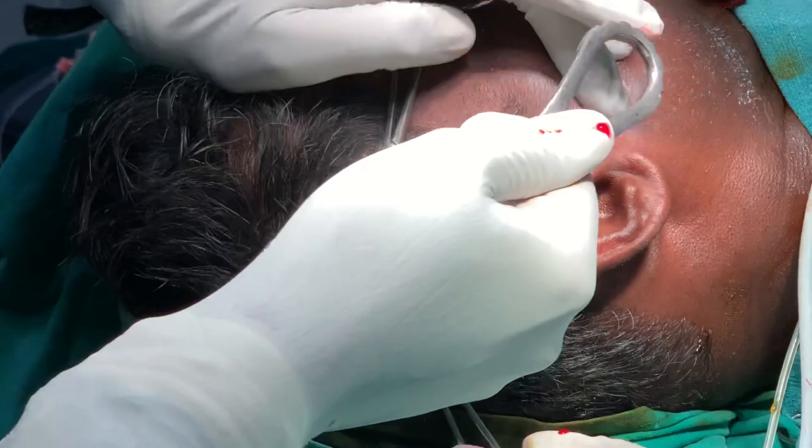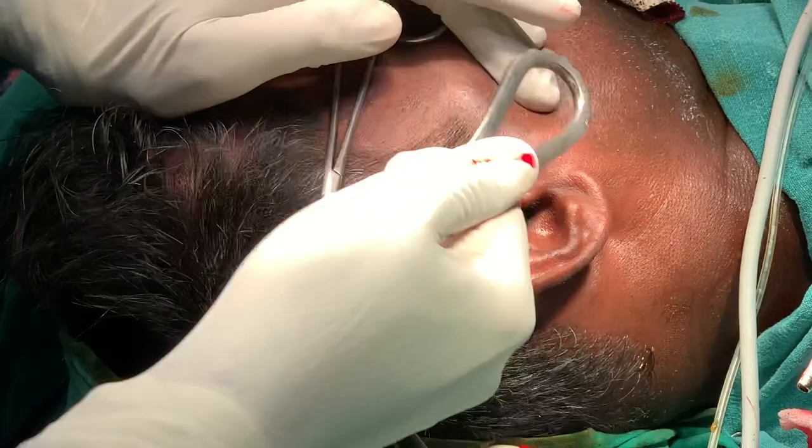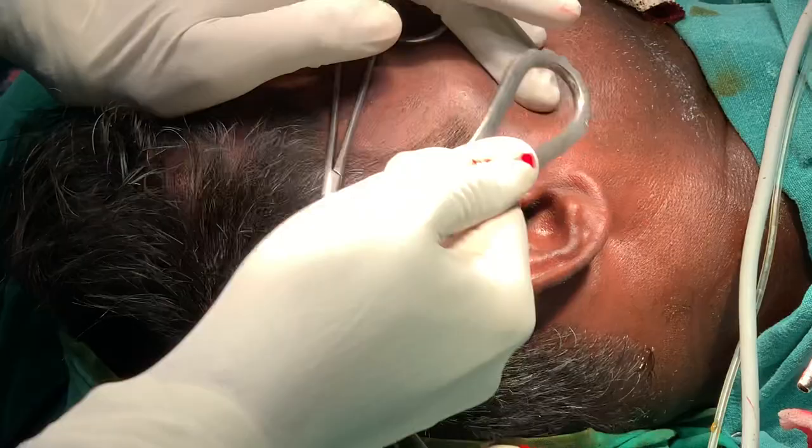These kind of displaced arch fractures cause difficulty in mouth opening for a lot of patients, because the fracture impinges on the coronoid process of the mandible. It's a simple reduction process and we're done with this.